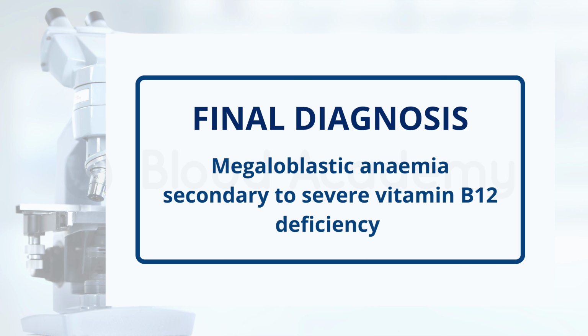The final diagnosis in this patient was indeed severe vitamin B12 deficiency. The patient had a very low vitamin B12 level, but had a normal blood count only 3 weeks after starting intensive replacement therapy. His low vitamin B12 levels were due to a diet absent of foods rich in this essential vitamin, namely meat, fish, poultry, eggs, and dairy products.